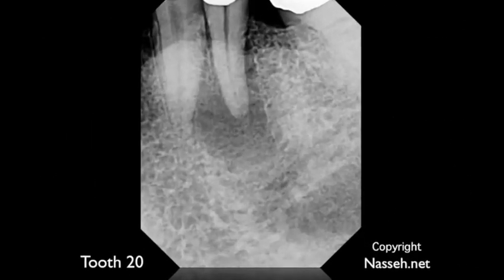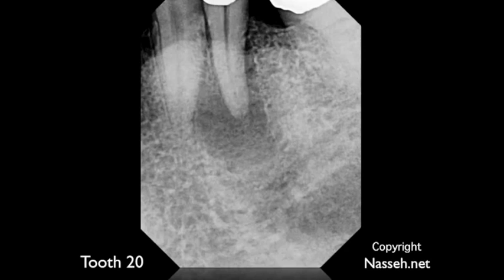The first case is tooth number 20. The patient presented with a large periapical lesion — a teardrop-shaped lesion with a sinus tract. There was no probing around this tooth, and usually you see a teardrop-shaped lesion in teeth where there is a high likelihood of a root fracture.